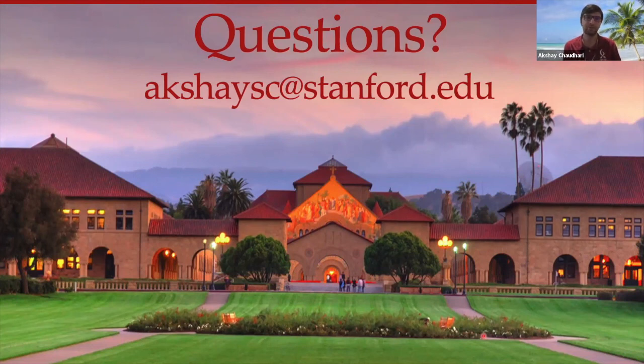And this again depends on the cohort that you're looking at. There are different cohorts that exhibit faster changes. So if you tear your ACL, you're more likely to have early osteoarthritis compared to a cohort that did not injure their ACL. And in that cohort, it's been shown that we can see T2 changes within 1 year after your injury too. So I think that question is still up for debate just because we haven't been able to collect as much data as we would like. And hopefully with these fast imaging sequences, we can deploy the method widely to really start collecting data sets in large populations to precisely answer that question.